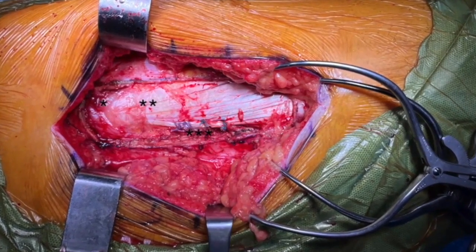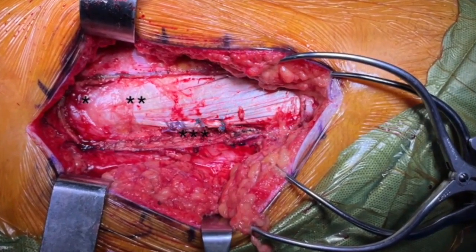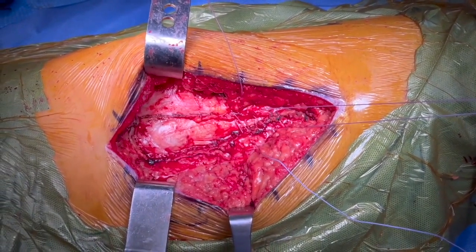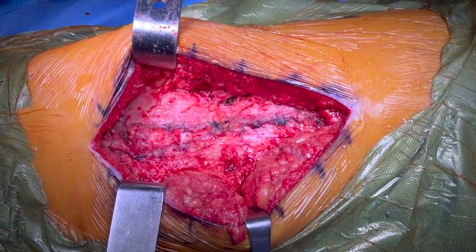Repairing the intermuscular septum with interrupted orthochords in figure of eight is an important step. Then we begin the repair of the harvest site with interrupted sutures and eventually close it to the greater trochanter, re-tensioning the gluteus and the ITB.